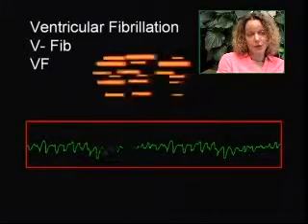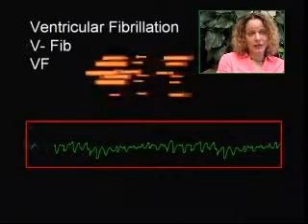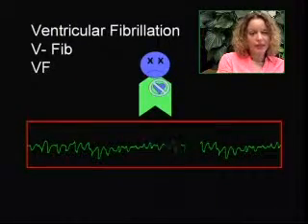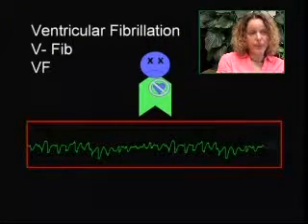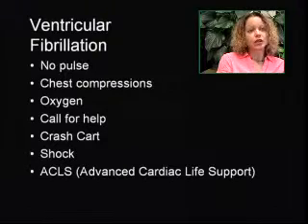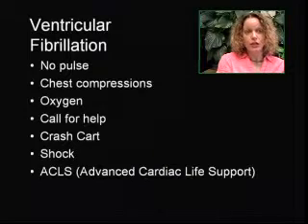So ventricular fibrillation, a tracing of that would look like this. And this means that the heart is not pumping. So this is very bad and requires chest compressions, oxygen, a call for help, the crash cart, shock, and advanced cardiac life support. Okay, because this patient has no pulse.